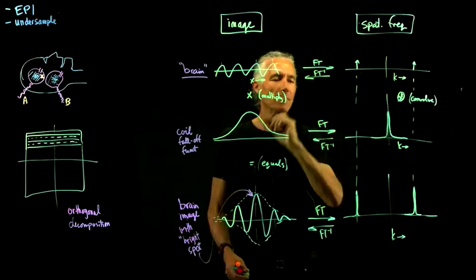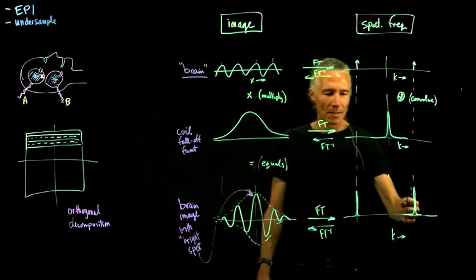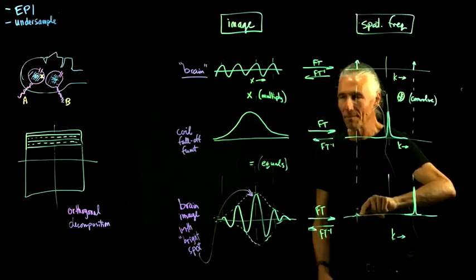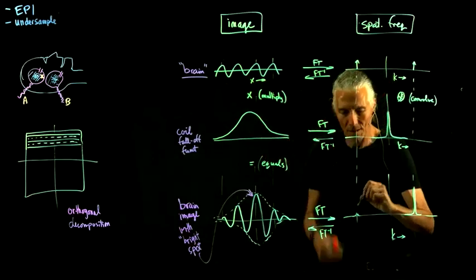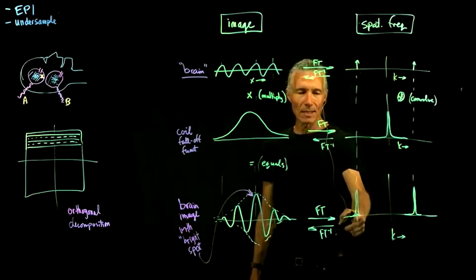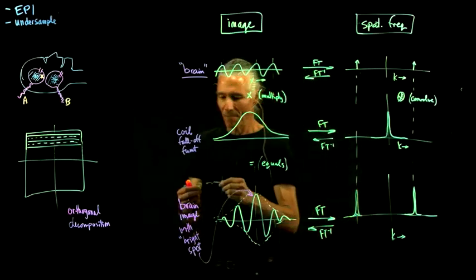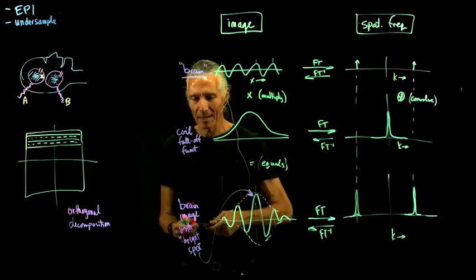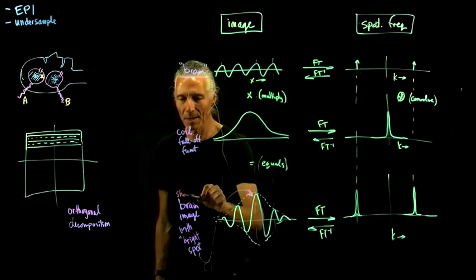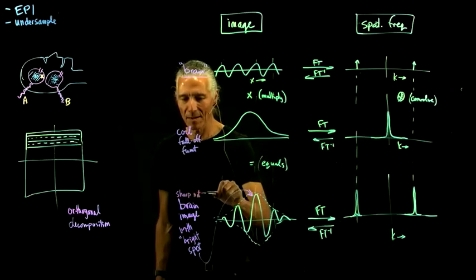We've blurred the spatial frequencies of this original signal, which used to have just 2 little spikes in it. We haven't blurred the image. All it does is make an image with a bright spot. It makes a sharp, not blurred, brain image.